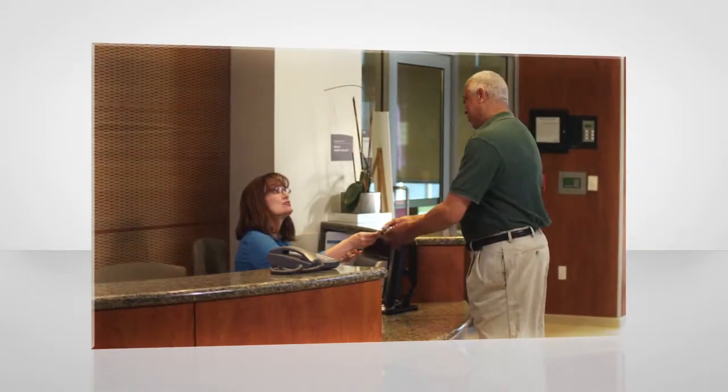Try to go about cancer treatment as almost another errand in their day. The comfort of knowing that my treatment is not only precise and accurate, but can be delivered in a very short period of time allows the patients to get on with their life and not have to spend so much time here in treatment.